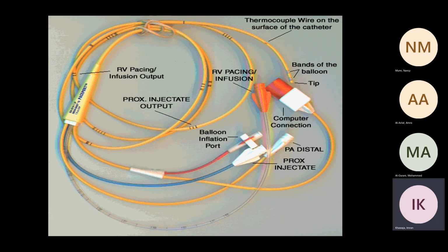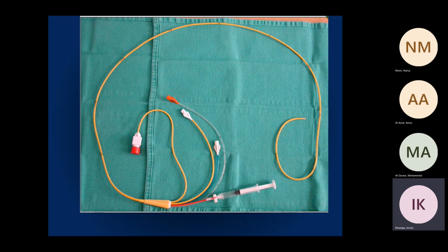And like I said, there are different versions. Some of them have options for oximetry. Some have options for measurement of right ventricular volume or ejection fraction. Okay, that's just another picture.